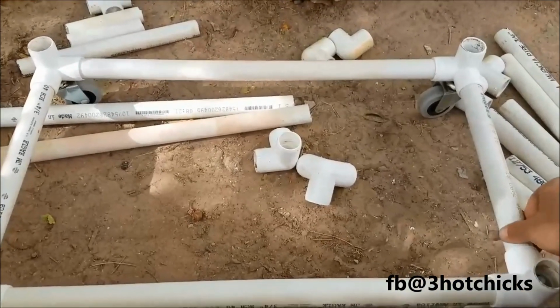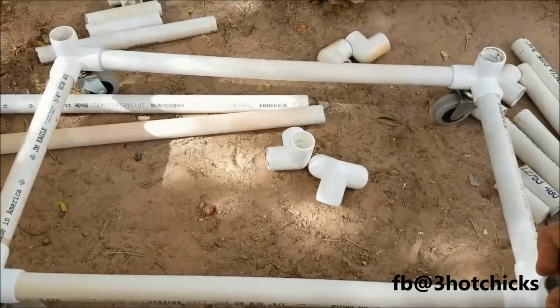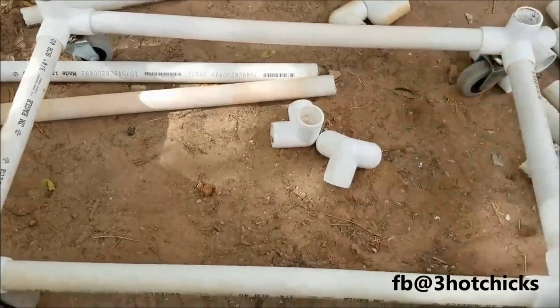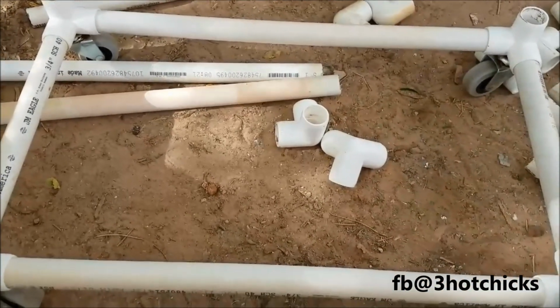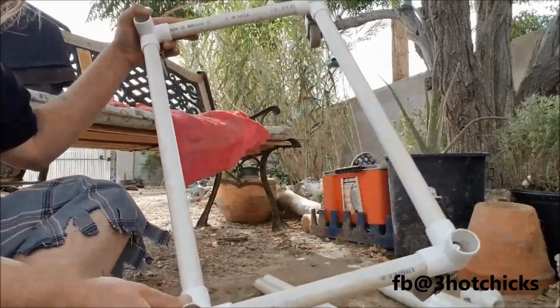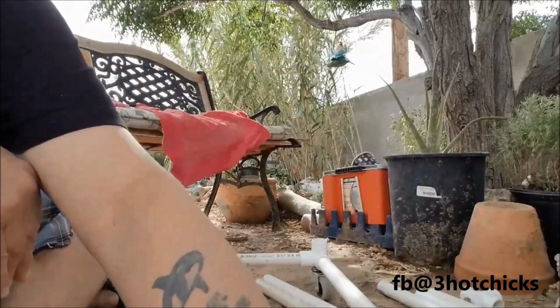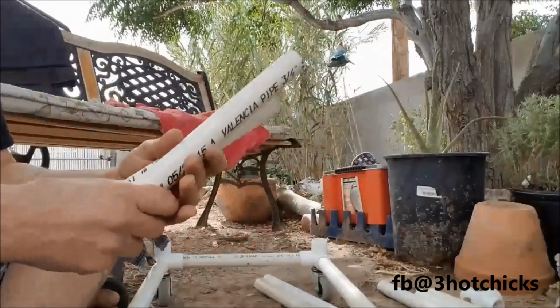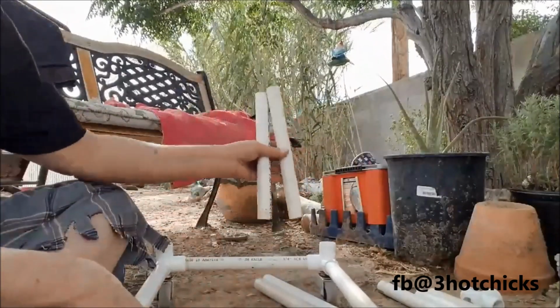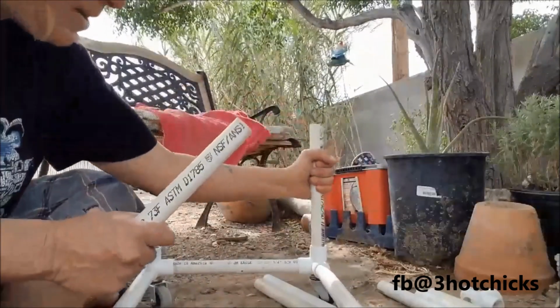So we've got our 2 length pieces. We've got 4 3-way fittings, the 2 length here, and then the wheels are on the bottom. And now I'm going to put the rest on. So now we got our base. That's our base. And then we're going to put the height on. So we've got 2 cut the same here that I put in the back. I'm going to just pop them into the PVC in the back.